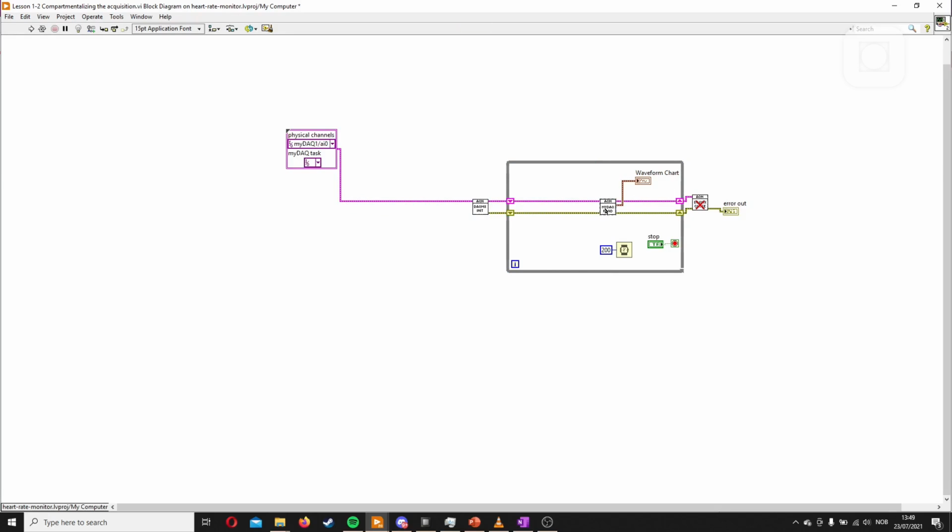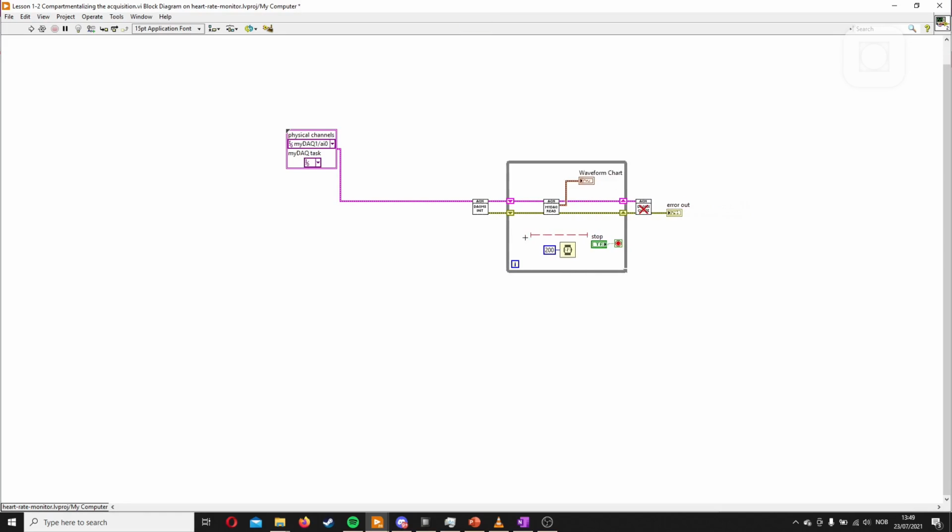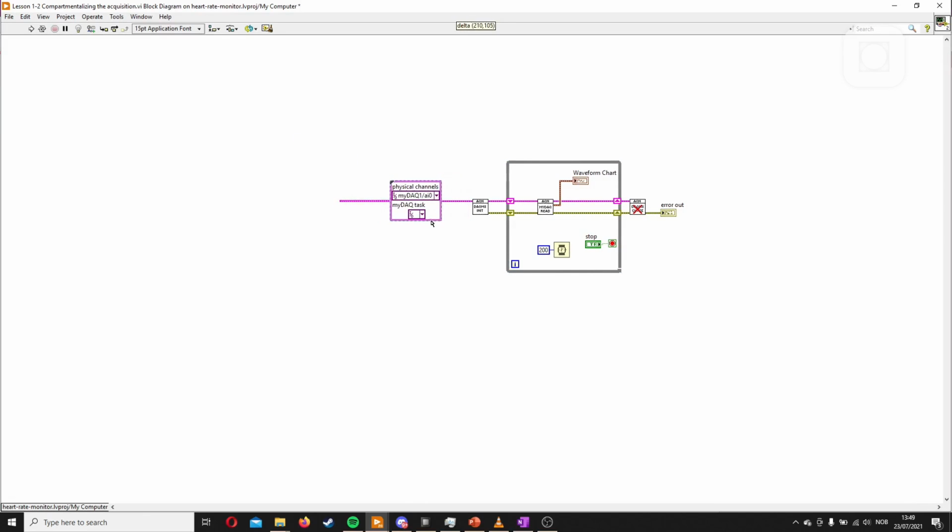This one's down, down. And there we go. And I'll move this one a little bit closer too, just for the sake of it. There, much smaller, nice function, very easy to view what's happening. It initiates there, it's myDAQ, it reads here, and then it closes here.